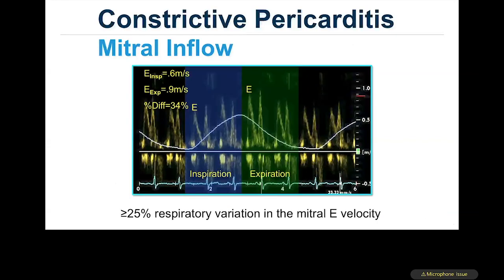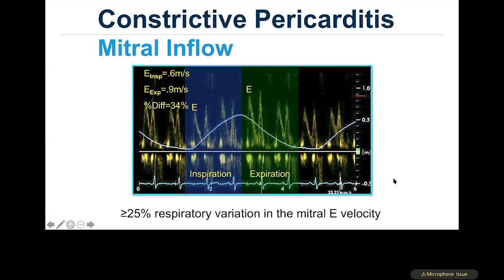In a transmitral filling pattern example, looking at the peak E-wave velocity from inspiration to expiration, a large change from 0.6 to 0.9 m/s — a 34% change — is seen. A respiratory variation in mitral E velocity of more than 25% is useful for confirming the presence of constrictive pericarditis.